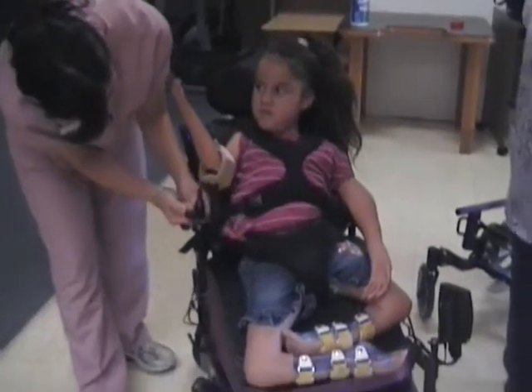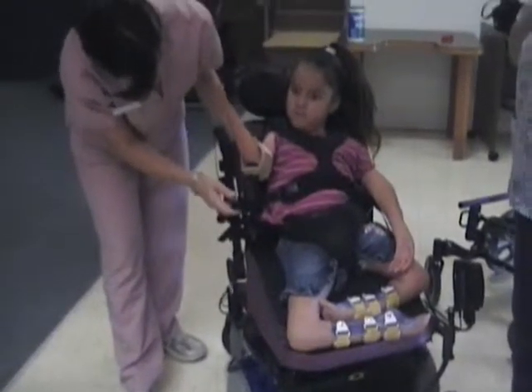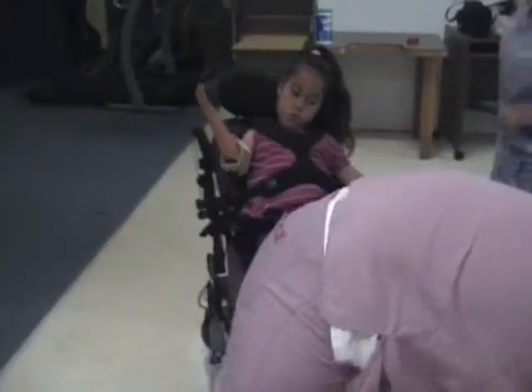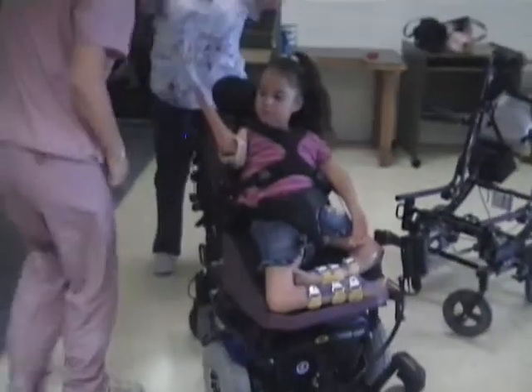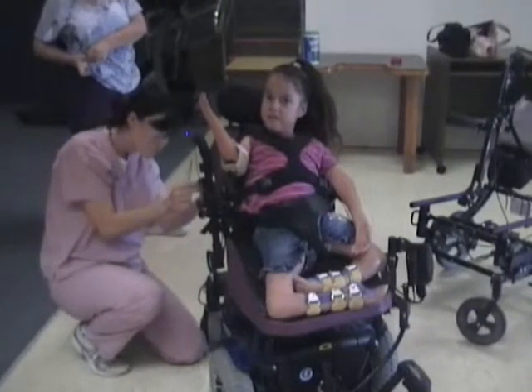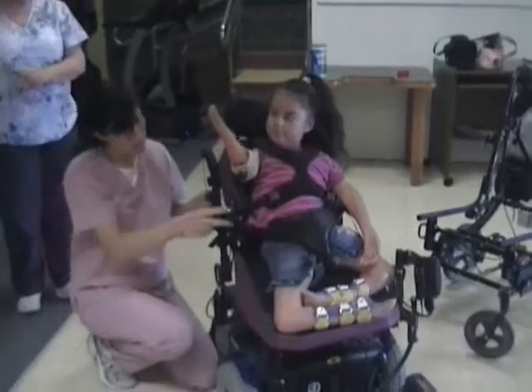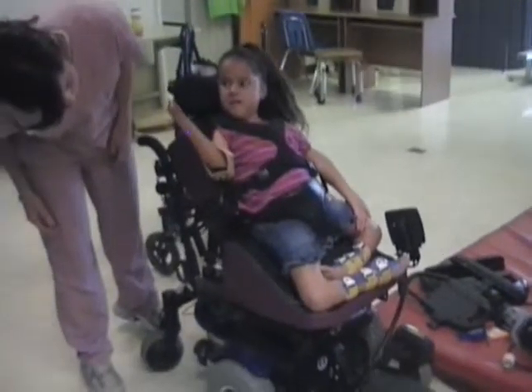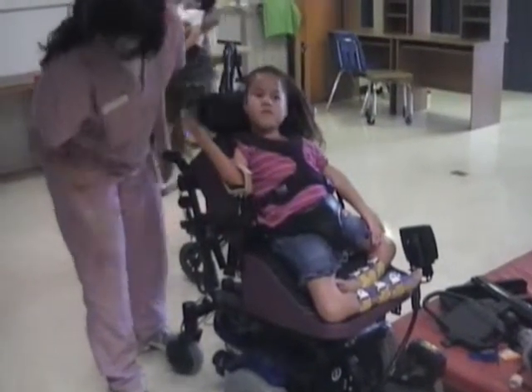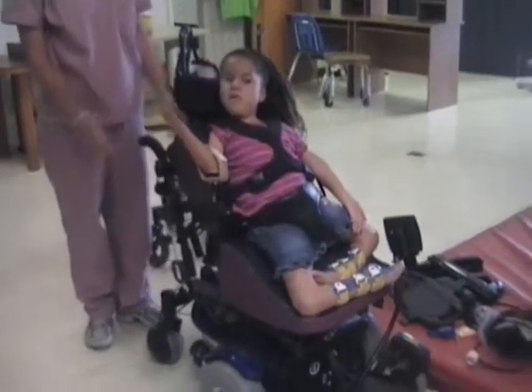The team makes adjustments to the elbow control during the training session. It looks like it's farther back — a little off. They work to reposition it, noting it needs to go up more. Ariana begins to drive: going straight, heading toward the corner. The team encourages her: 'There you go, girl. You got it.'